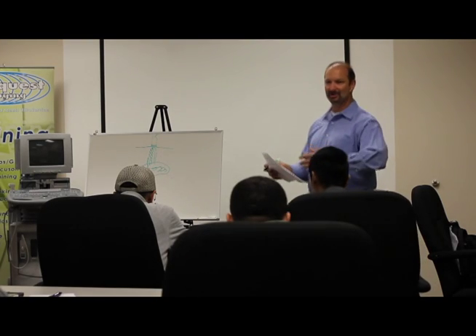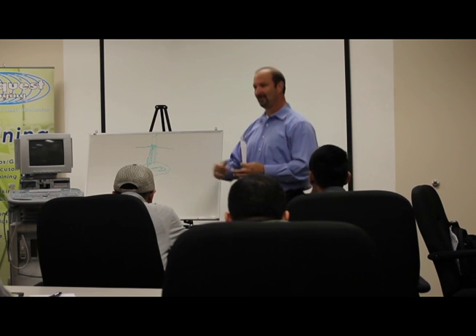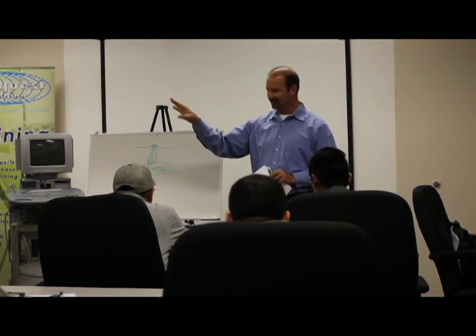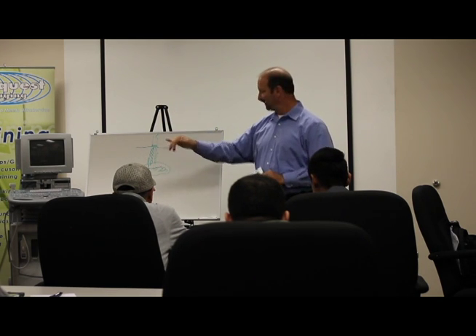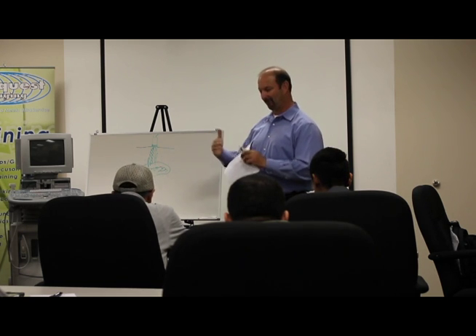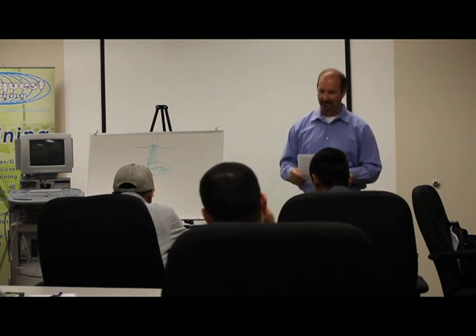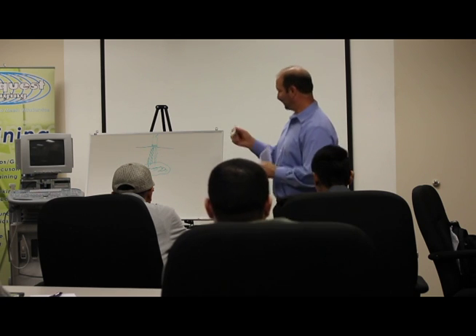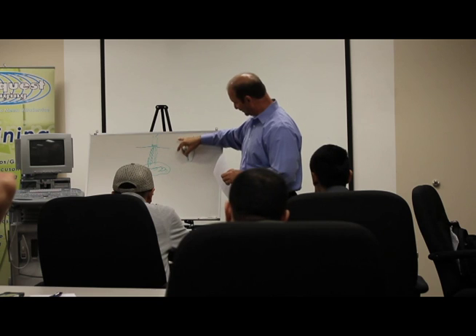All of our imaging transducers are pulse wave, meaning that crystal that we talked about sends information and then stops sending, and then the vibration that comes back goes back up through the cord and is stored. That's how it puts together the frames per image, and then the frame rate per second. So that's a pulse wave transducer. Continuous wave transducers have two crystals.